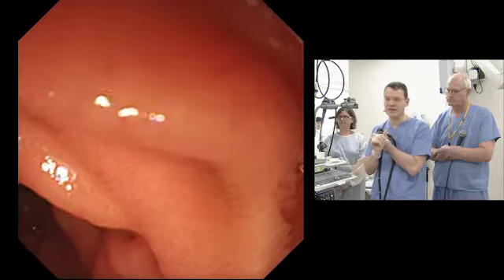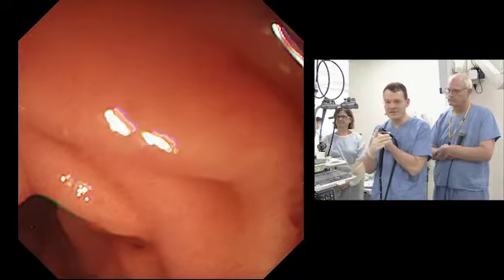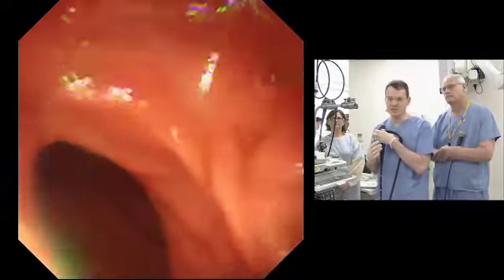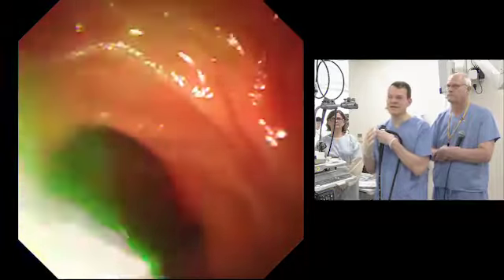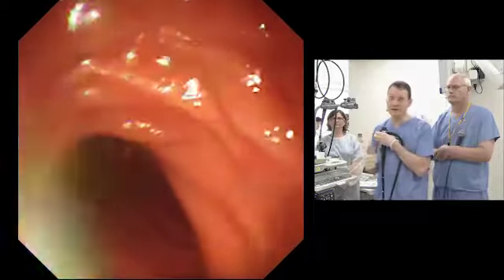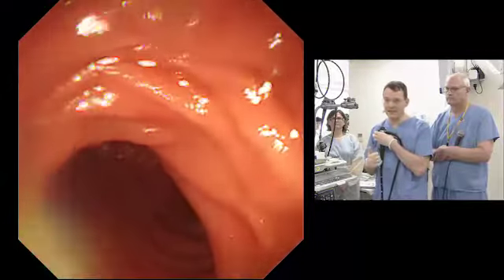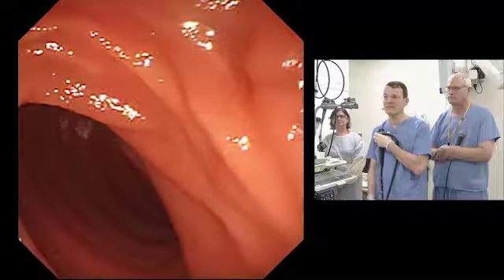That is a sign that there seems to be something more in the duct, not a compression from outside. The second interesting point with regard to the image is that the bile duct was not dilated. In such a situation, we for sure also think about pancreatic cancer, but we want to check first the papilla, because theoretically we can have a papillary tumor, or we can have something in the duct, for instance an IPMN.